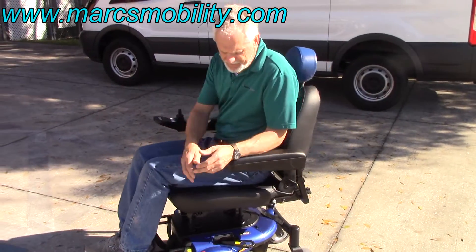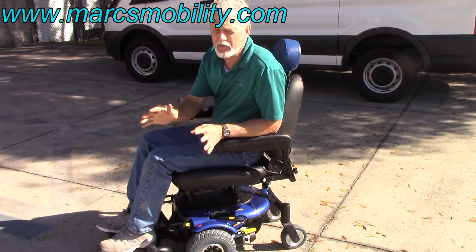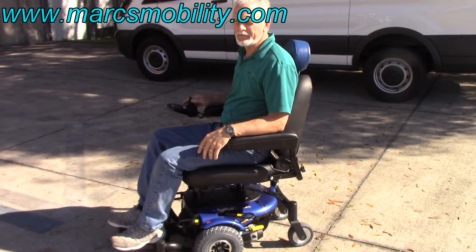This is a J6 with a custom black and blue seat. Very easy to drive, four miles an hour — it's not a fast chair, but it's a very comfortable chair, very sharp looking, and ready to go.